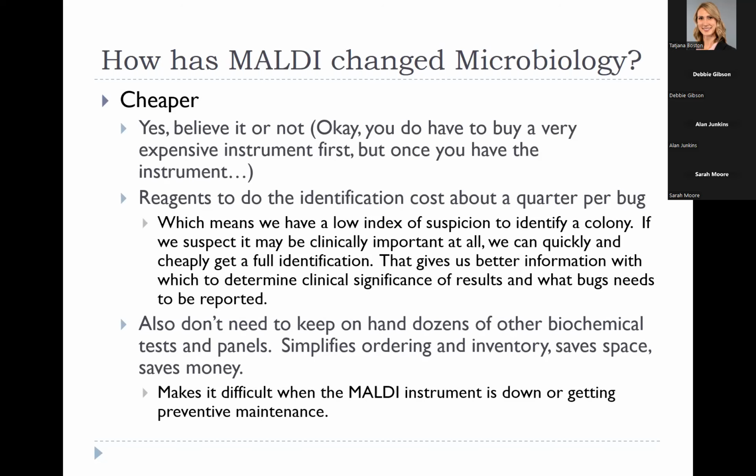Neisseria weaveri is one we've actually talked about in here before. No way could we identify that before, but now we know it's a pretty common cause of dog bite infections. Easy to treat. You use your amoxicillin, it's going to kill it, but still kind of cool to know. So when you look in the literature, here's the next problem: you see all kinds of things like this. These are all bugs that we've identified in our laboratory, most of them more than once.